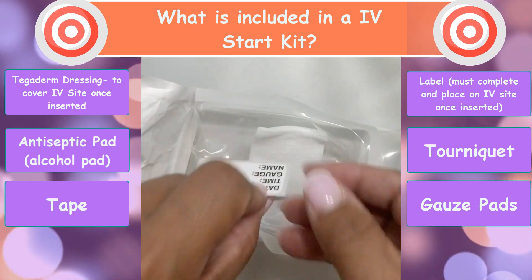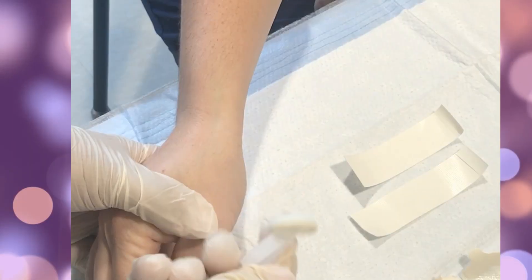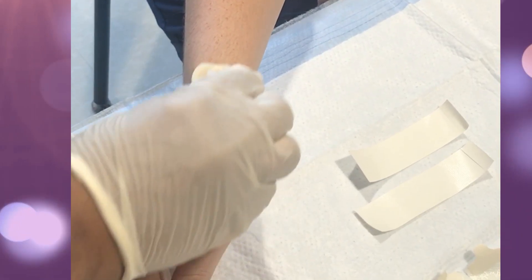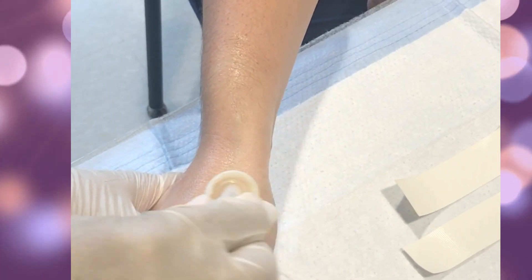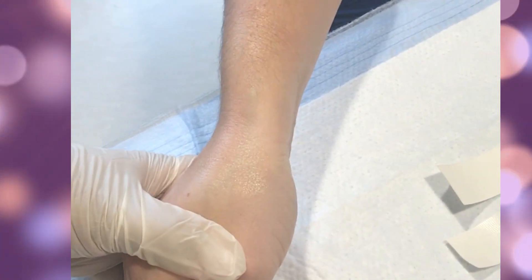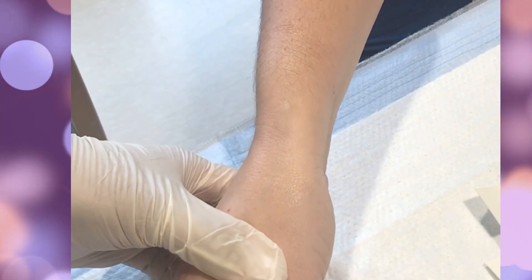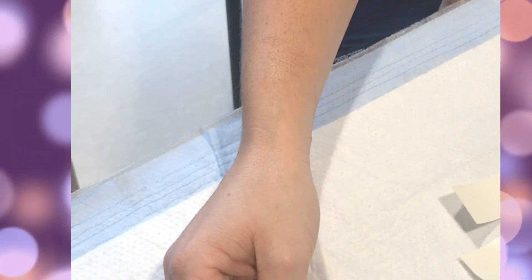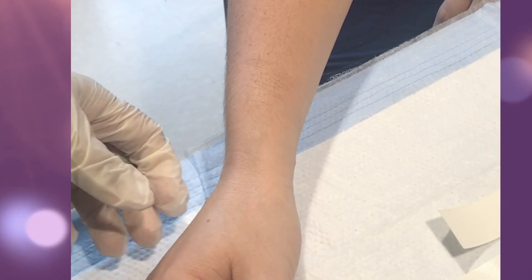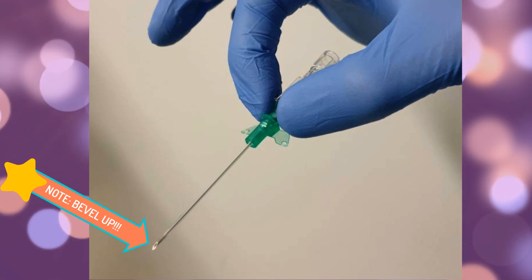You'll also see the patient label, where you put the date, time, gauge, and your initials, as well as 2x2 gauzes. Now I'm going to take my alcohol scrub and clean the skin where the IV site will be placed, moving from the inside out in a circular motion. It is very important that you do not blow on or fan the skin to dry it faster — you need to let the alcohol dry naturally, because you do not want to introduce any germs or bacteria that may be floating in the air.